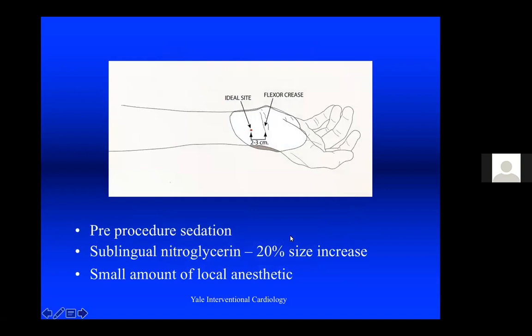Obviously, pre-procedure sedation is key for any of our procedures, radial or femoral. There are some operators who suggest a sublingual nitroglycerin as you get started, which will increase the size of the radial artery slightly.